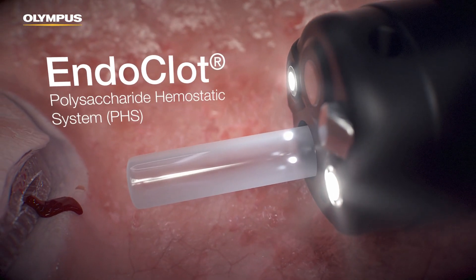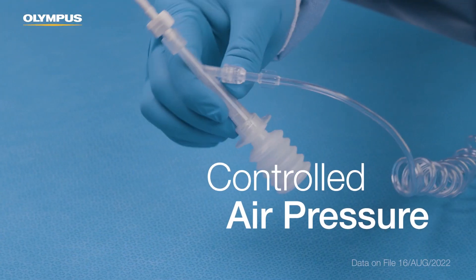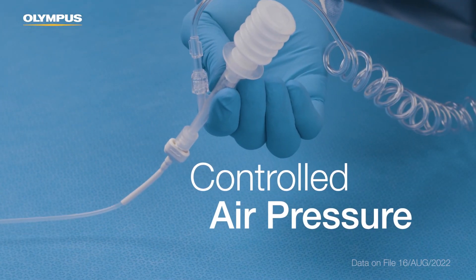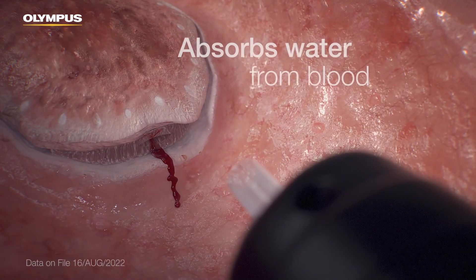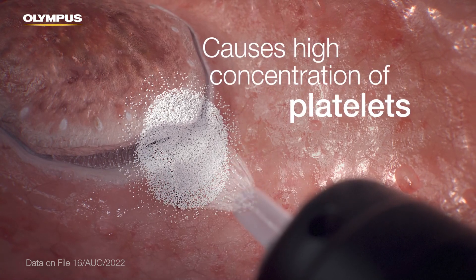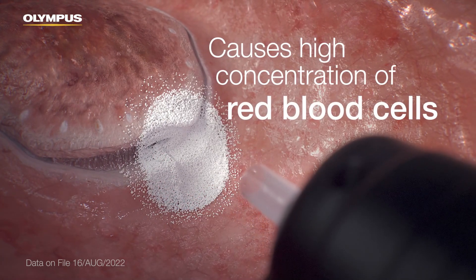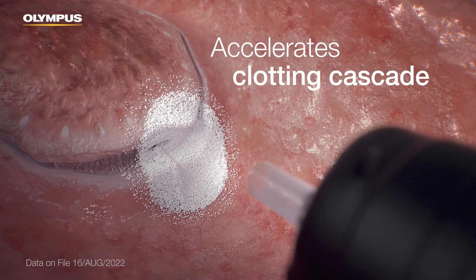Endoclot PHS is an advanced powder hemostat applied during the procedure using controlled, consistent air pressure. It absorbs water from blood while causing a high concentration of platelets, red blood cells, and coagulation proteins, thereby accelerating the clotting cascade.